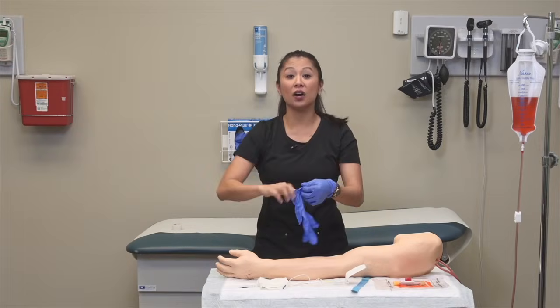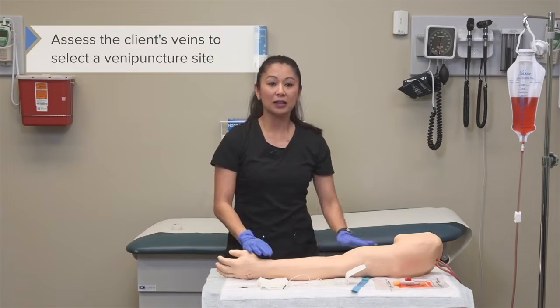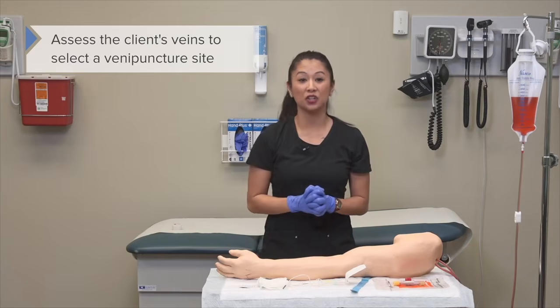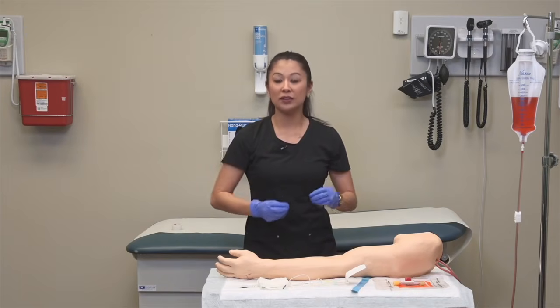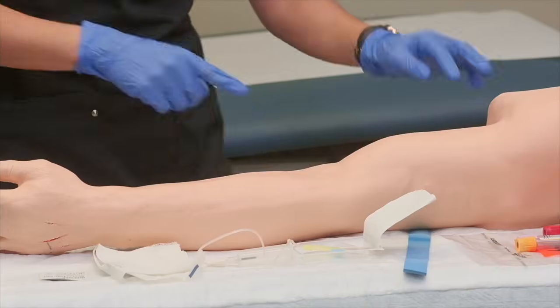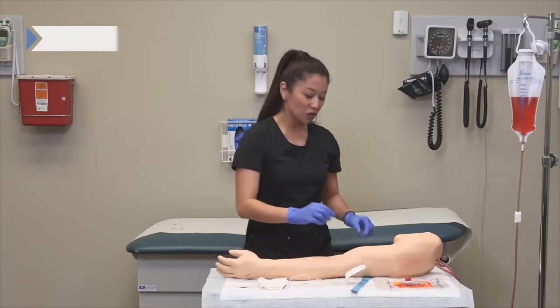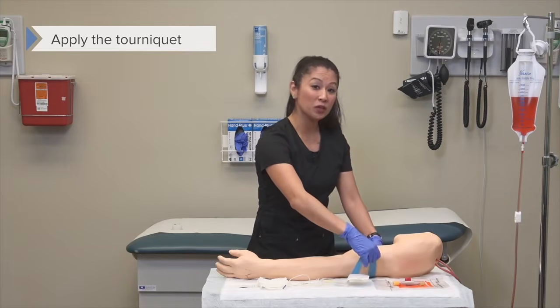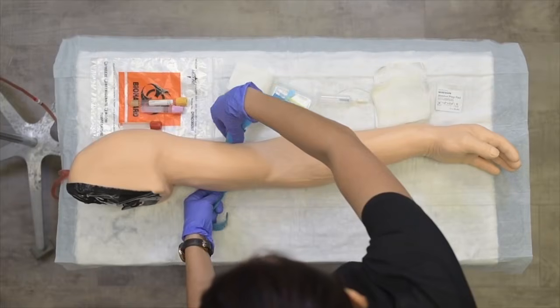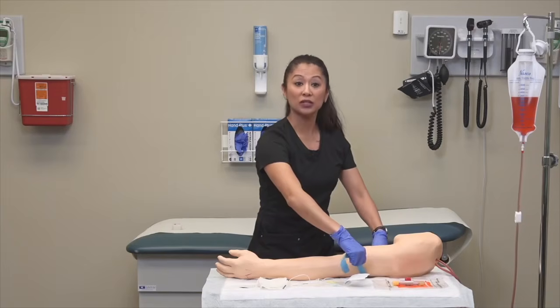Okay, so when we don our gloves, it's important here to assess the client's veins to select which venipuncture site we would like to use. Many times it's very common that you will see a venipuncture in what we call the antecubital or the AC site. So now we can go ahead and apply our tourniquet. If you remember when we do our tourniquet, I like to hold it a little bit closer here, and this is just going to provide some more tension.